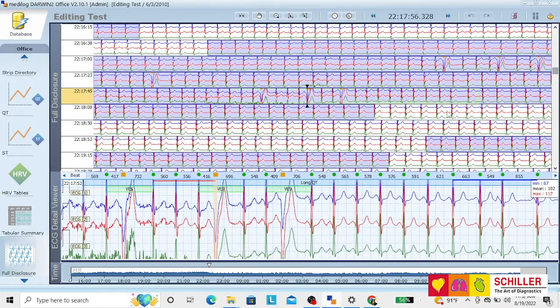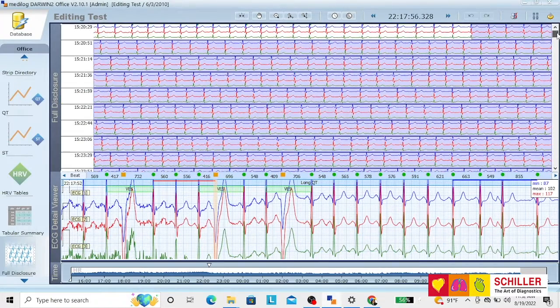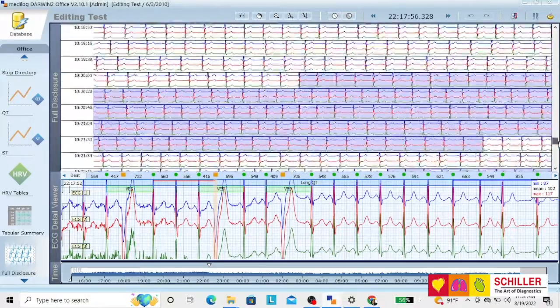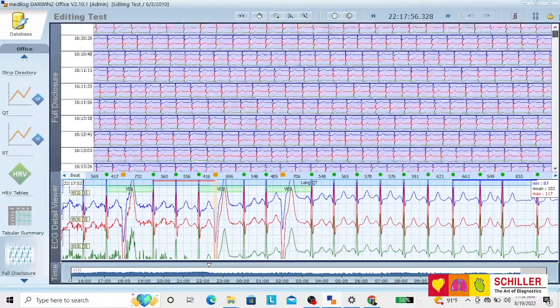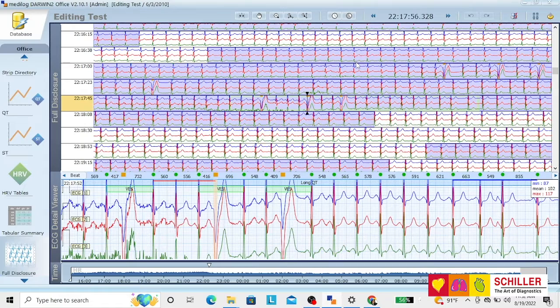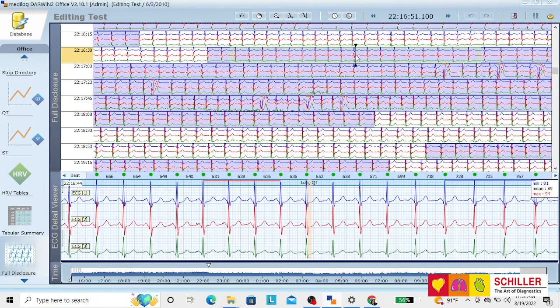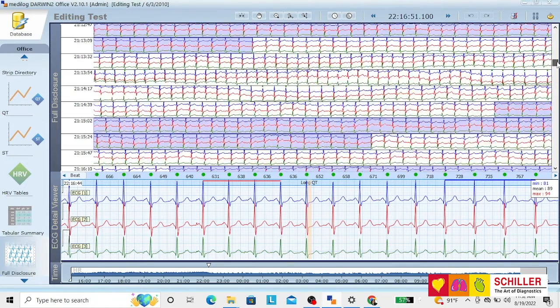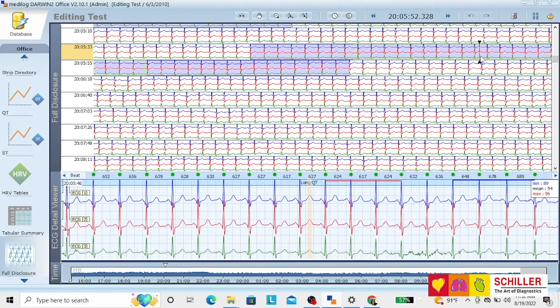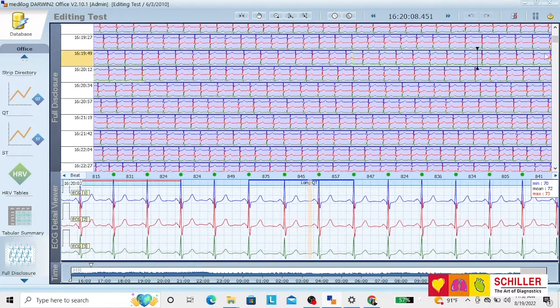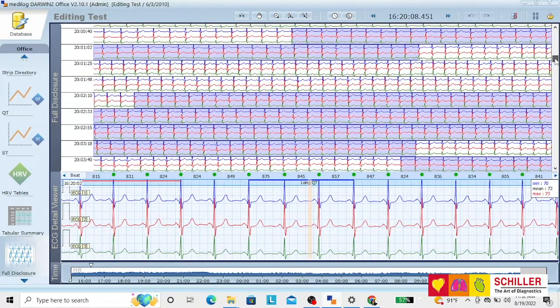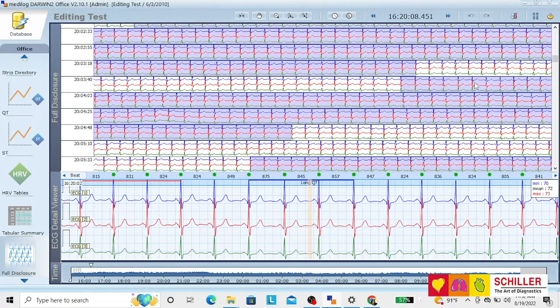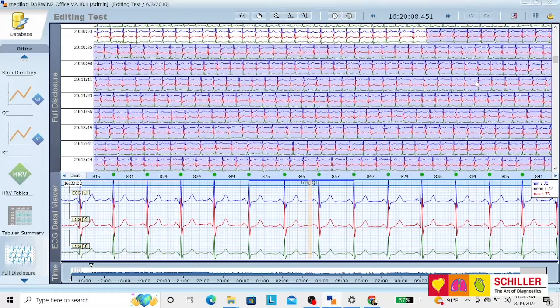Full disclosure. The whole recording is displayed on the three channels in front of you. You can scroll up or down. Every part that's in blue means that there's something happening there, an automated detection of anything. Here we have long QTs, or you can have also ventriculars, whatever is detected by the machine would be in blue.